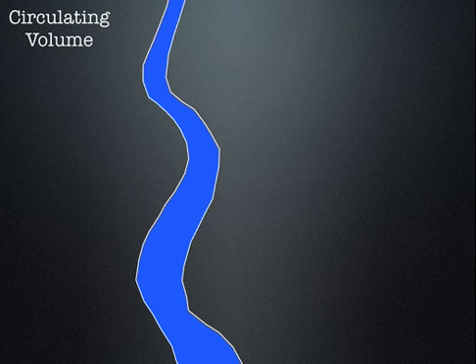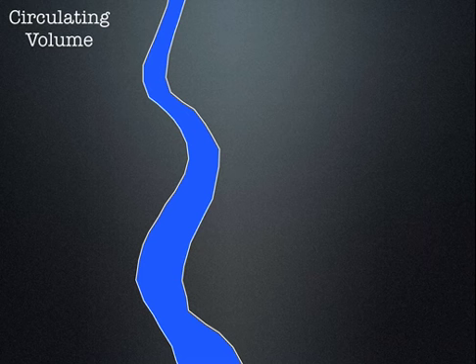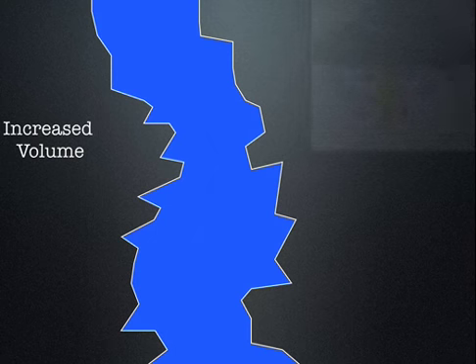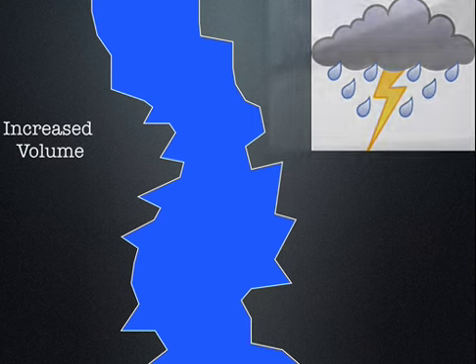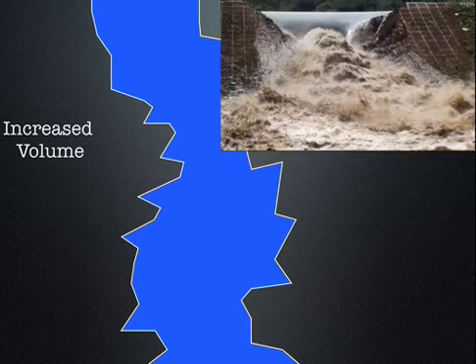Let's take a step back, and let's really get to the bottom of what the IVC is telling you. The way that I like to illustrate this is imagine a river that's meandering along. It's contained within its margins, within its shoreline. It's a normal river. But the next day you come back to that river and now it's flooded and there's water out past the margins. There could be a few reasons this happens. Maybe there was a big rainstorm overnight. Maybe they opened the floodgates on the dam, putting more water in the river. Maybe that dam busted. Now there's more water coming downstream and it flooded. But it could also be that they have put a dam downstream, okay?